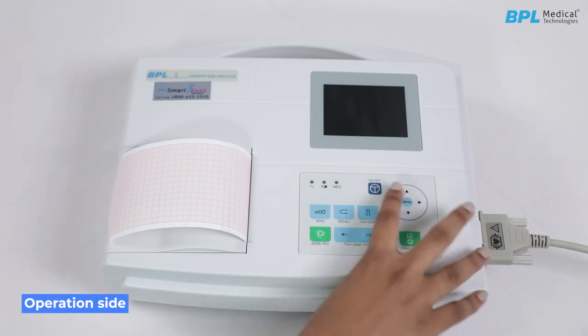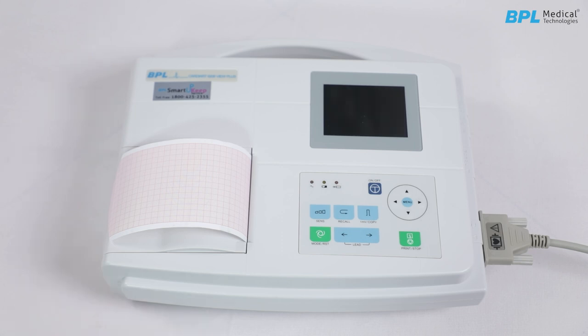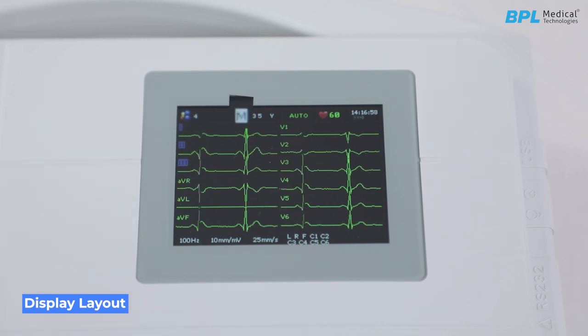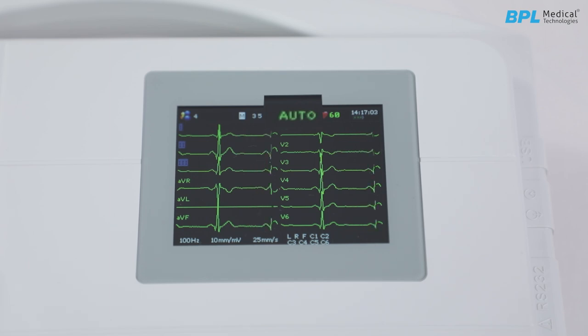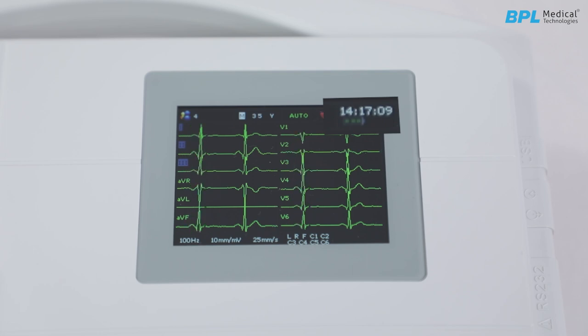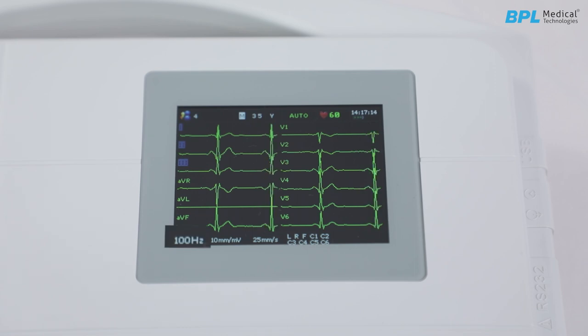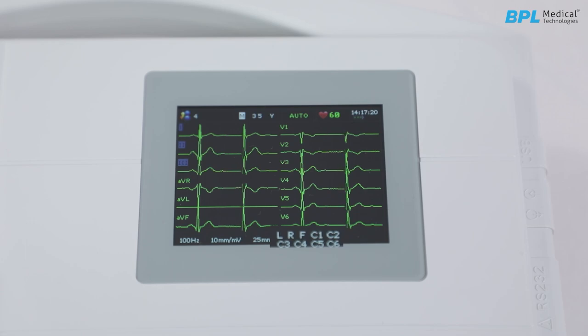Operation. Press the on-off key on the control panel to turn on the unit. After self-test, the 6208 View is ready for examination and recording. Display layout: at the top is the patient ID, sex, age, record mode (auto, manual, rhythm or off), heart rate, current time and battery capacity. Then is the ECG trace view, and at the bottom is the filter, gain indication, record speed and lead indication.